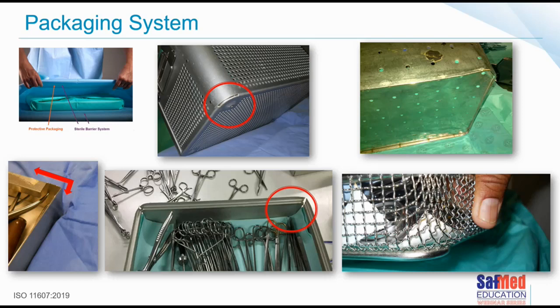We may find ourselves with very difficult to manage sets or trays, things that are heavy, things that have got protrusions or little foot pieces that stick out, or supports, or perhaps we've got some really older trays and containers with very sharp edges, or we've got wire baskets, and those wires sometimes come loose over time where the welding has deteriorated, again with a foot protrusion at the bottom of the tray.